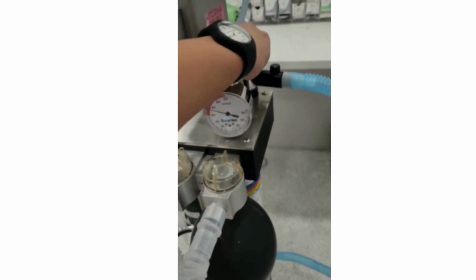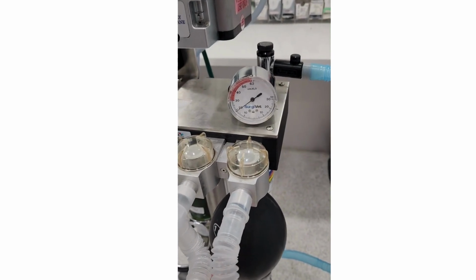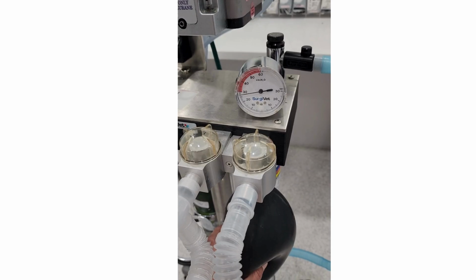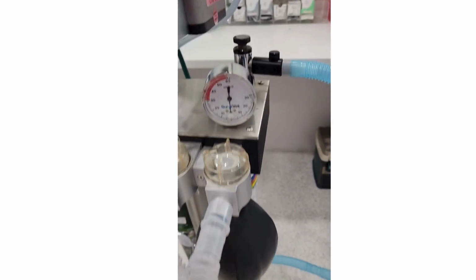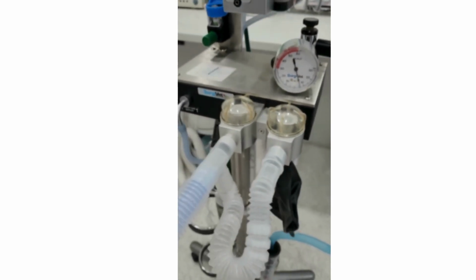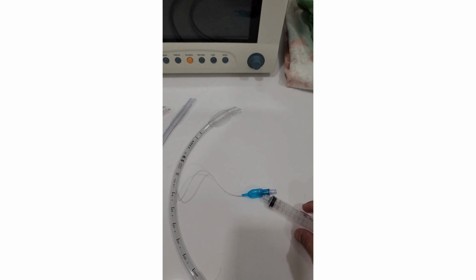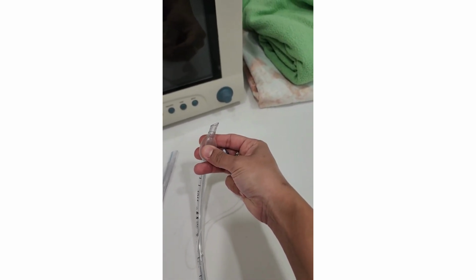If you have a leak, you have to check the hosing, check the reservoir bag, check the CO2 granules, make sure they are screwed in correctly, and that the scavenging system is hooked up correctly. Then I also like to check my ET tubes by adding air with a syringe and making sure that my cuff stays inflated.